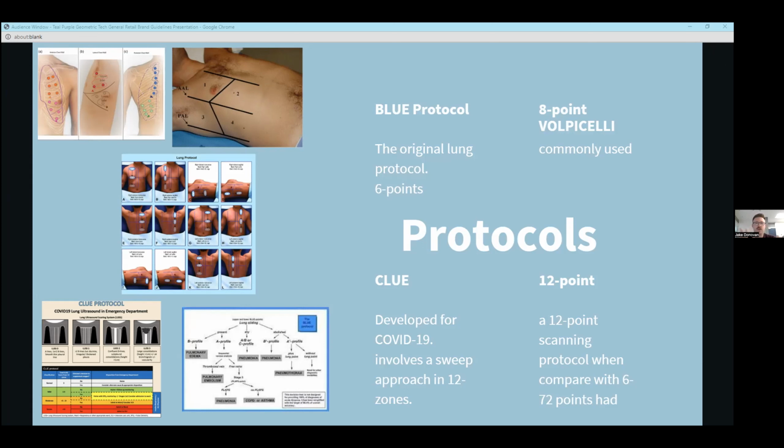And again, I'm not going to go into the protocol in any great detail, but what I really liked was that when developing this protocol, they tried to make something that was a mix between diagnostic accuracy, simplicity, and efficiency. So the protocol is not designed to pick up 100% of pathologies 100% of the time. It's really designed to pick up the most common pathologies you'll come across when scanning a chest. And it's designed to have a 90% accuracy for all of those things.